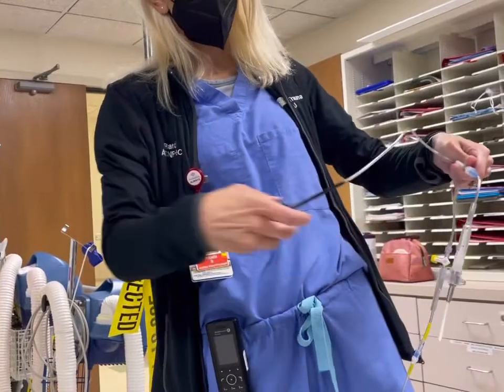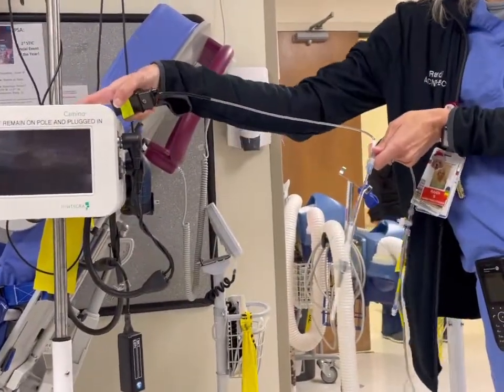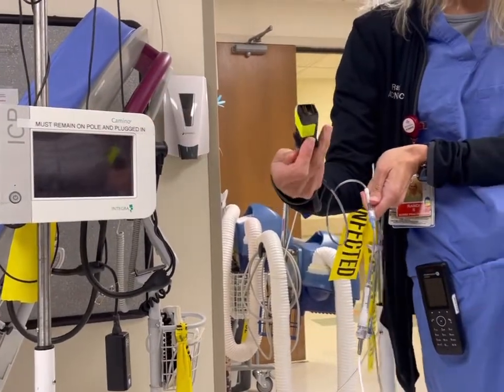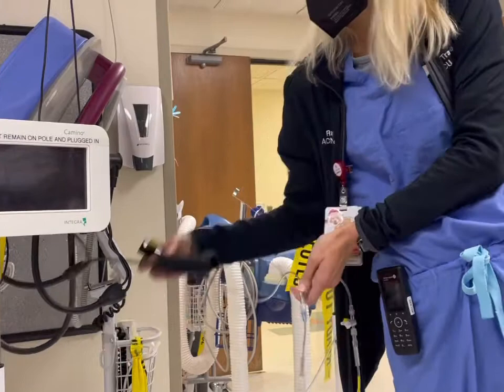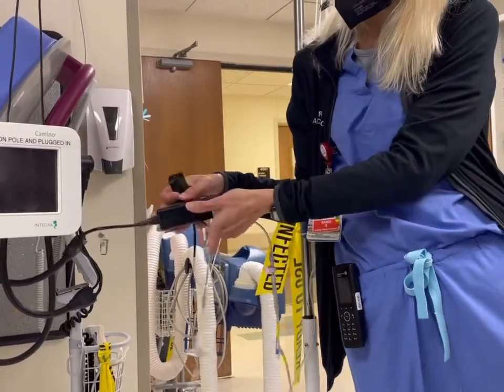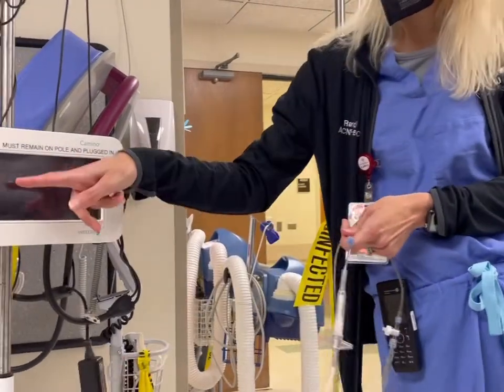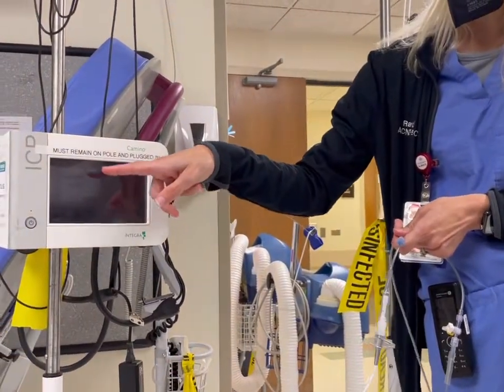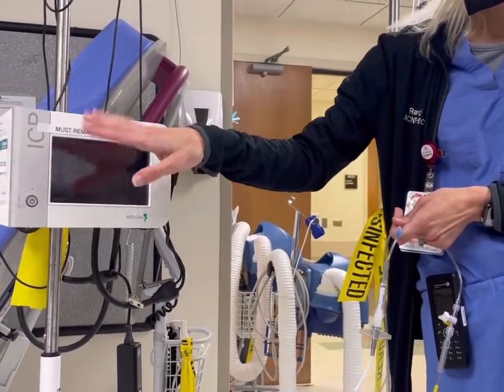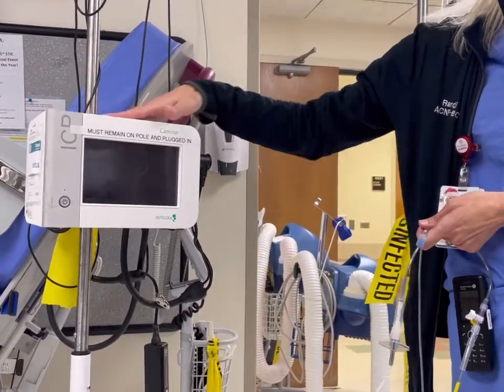You'll just have the bolt connected to the Camino device that is found in the break room. This little square thing is connected to this little square piece on the Camino system. And then when this is turned on and you actually have it connected to the patient, you'll see an ICP waveform on this, and you're able to zero it and everything on the Camino. And that's where you'll be reading the ICPs from.